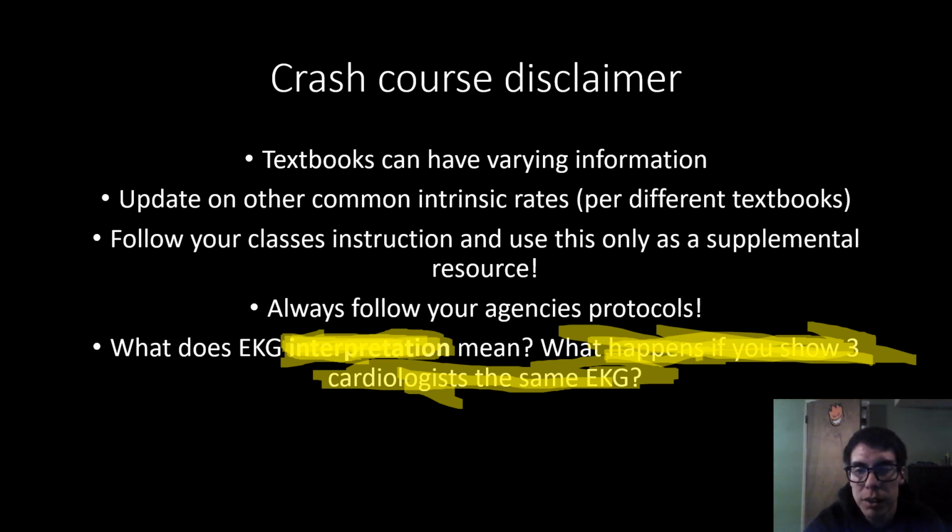So learn from me. Alright, so next, the last video that we're going to have, this is the last instructional video teaching things. You've learned all of basic EKG now, and you should be able to read 4 leads. The only video we have left is our final rhythms. We're going to do a final practice test type thing, where I'm just going to show random rhythm strips of all different types that are within 4 leads: sinus, atrial, junctional, ventricular, and also some agonal and paced rhythms. And we're just going to break them down as we go.